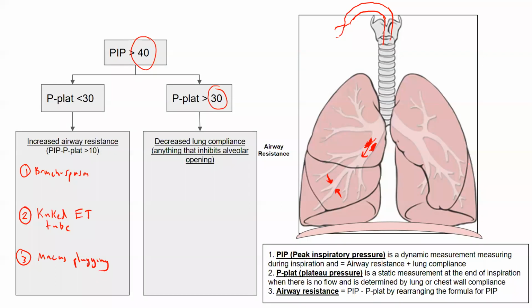Edema. Yeah, really anything that changes the alveoli, right? Anything that causes alveolar filling, like ARDS, pulmonary edema, pneumonia, and then anything that causes increased elasticity or lowers the compliance, like alveolar thickening, such as someone with interstitial lung disease, may have a high plateau pressure. So perfect, the first one is really alveolar causes. And I think the biggest one you're going to see most commonly is ARDS in someone in the ICU. What other things can maybe do this?